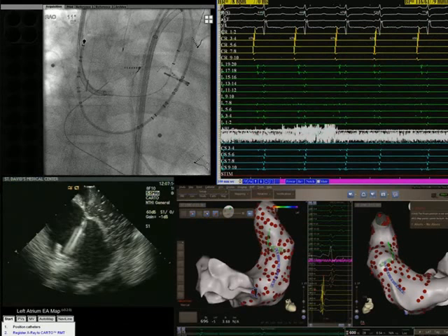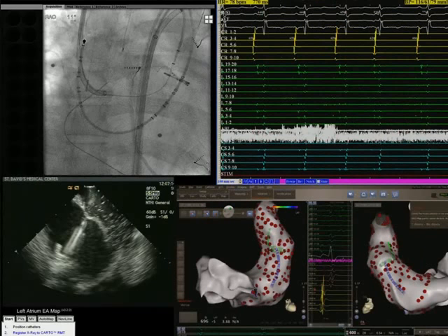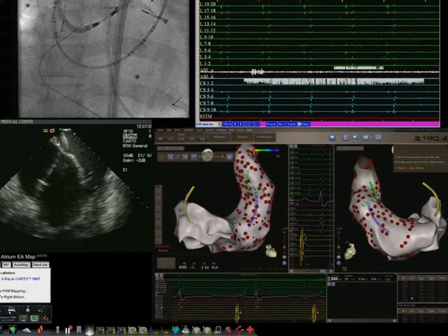So the point here is we were showing our gaining access to the left atrium after we'd isolated the SVC, and how difficult it was to do that. The only strategy we had was to use a deflectable sheath. If you use the dilator within the sheath, it would always pull our catheter down and away from the fossa. So what we had to do is leave the sheath without the dilator there and then use an RF wire, which is an off-label application for that technology, but that was the only way to get across to the left atrium.